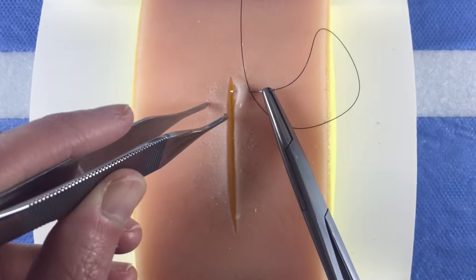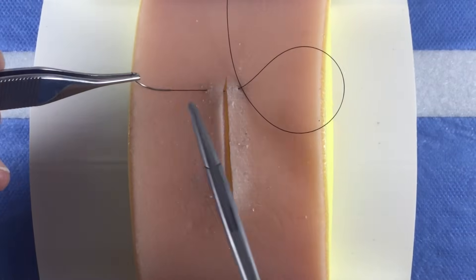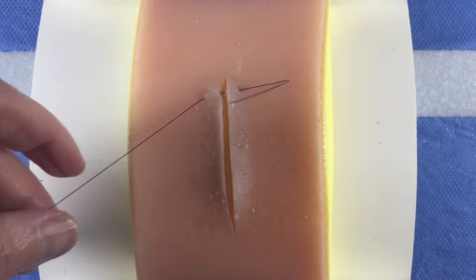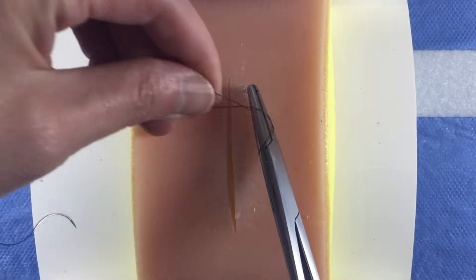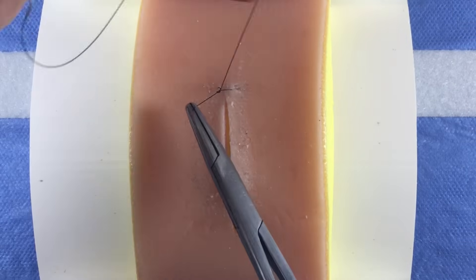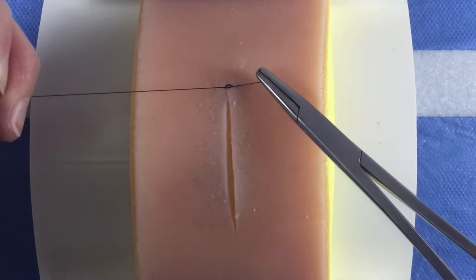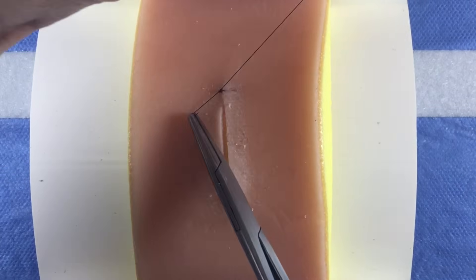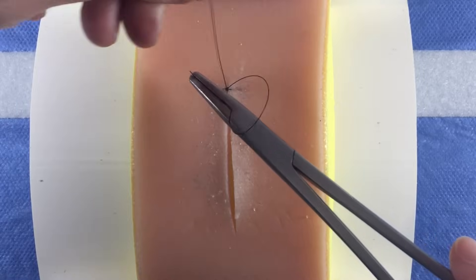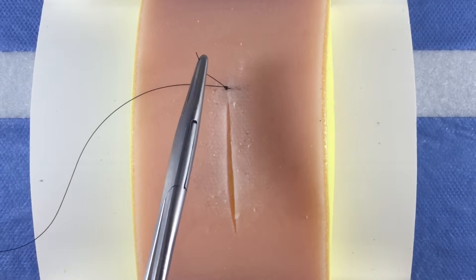To perform a simple continuous running or baseball stitch, start at the apex of the incision. Anchor your suture by taking the first bite across the wound edges as you would a single interrupted stitch. Bring the edges together by tying the suture using a hand or instrument tie. Cut the free end of the suture short.